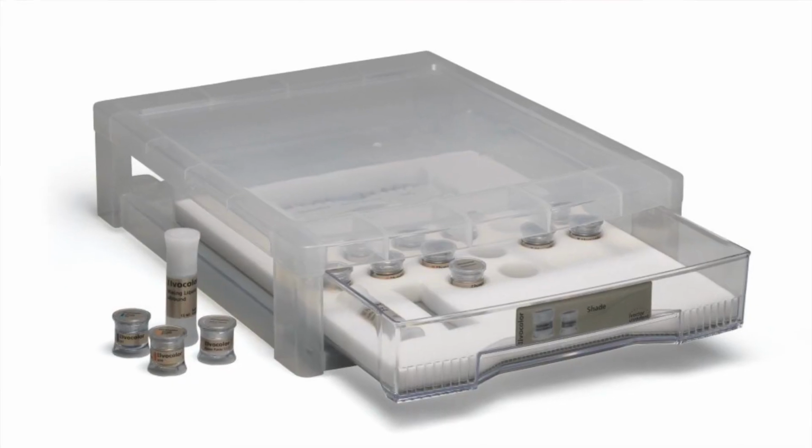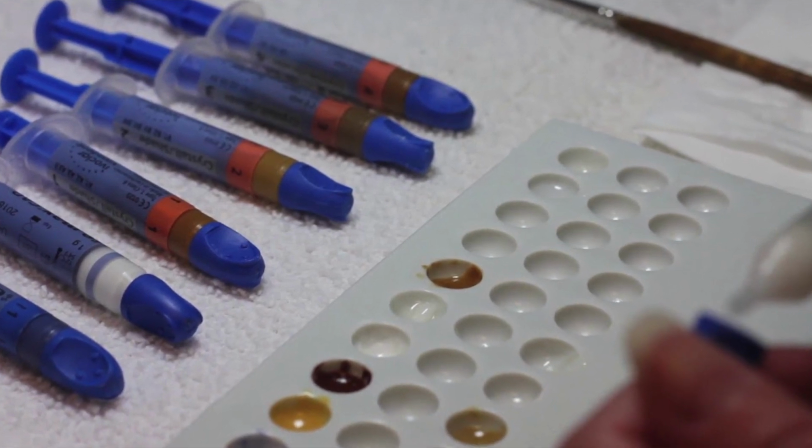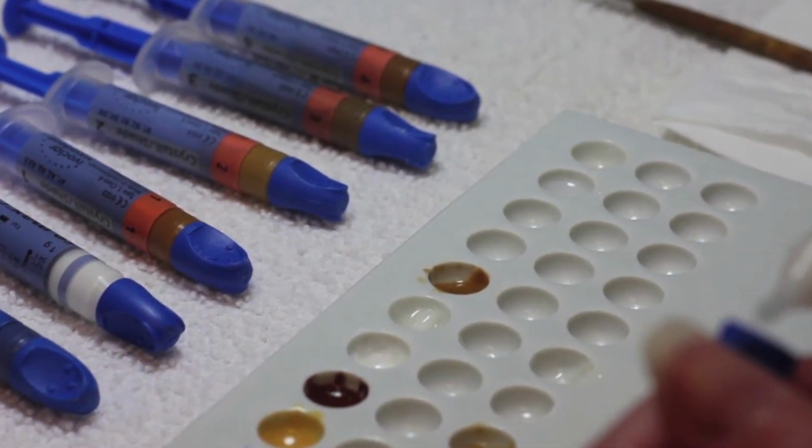crowns, which is an option with CAD-CAM. A lot of times with those I'll do 2 appointments if I want to really play with it and make it look nice and not feel the pressure of trying to get it done the same day. So because of my clinical practice right now, I am doing 2 appointments for anteriors. A lot of times I'm not spray glazing anterior restorations. I prefer to use a paint-on glaze. Now the system I'm currently using for that is IPS Ivocolor by Ivoclar Vivadent. In the past I've used the e.max Crystal stains and I still use those. I'm not opposed to those at all, they're great.